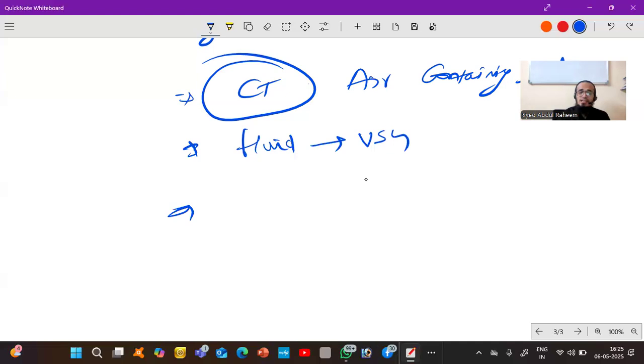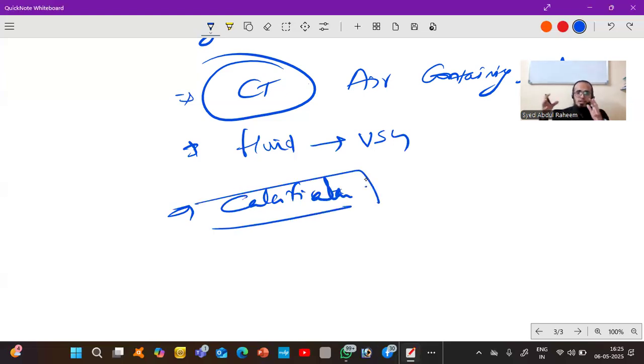Next, if you want to know about calcification. Basically, calcification means there is a deposition of calcium. If the deposition of calcium is within the parenchyma, within the structure of the organ, we will go through USG again, like gallstone, GB stone, calculi, renal calculi.